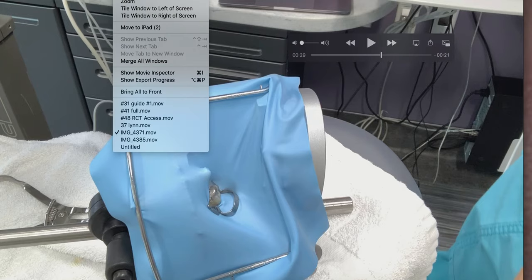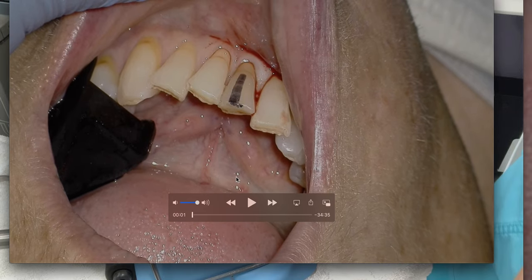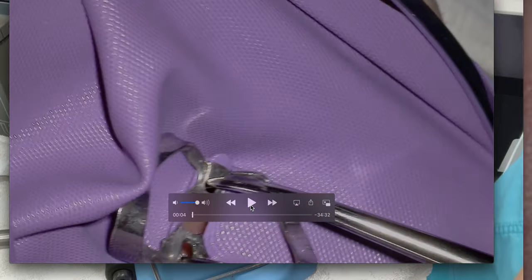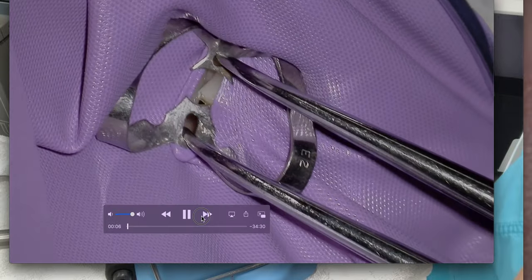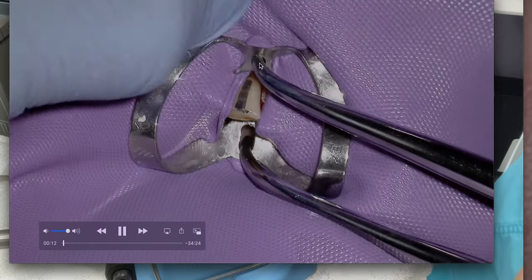When you're doing an anterior tooth — let's go with tooth 41 — you can see I've labeled this tooth because I don't want a patient safety incident; I want to make sure I'm putting the rubber dam on the right tooth. This also lines me up with the long axis of the tooth, so it's a helpful reminder. The rubber dam goes right on there, and this is the beauty of the 210 or 211 winged anterior clamp — it has a labial bow so you can put everything on at once.